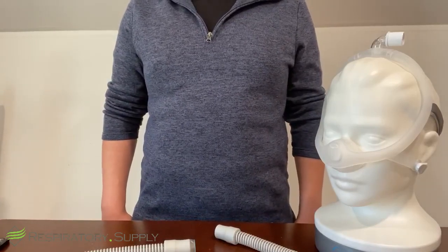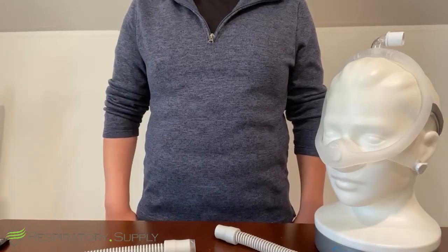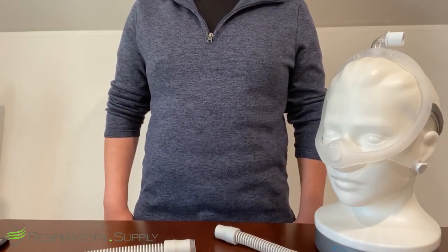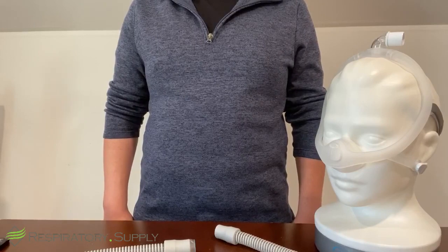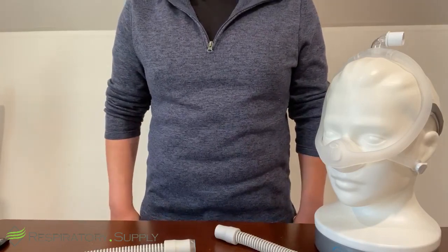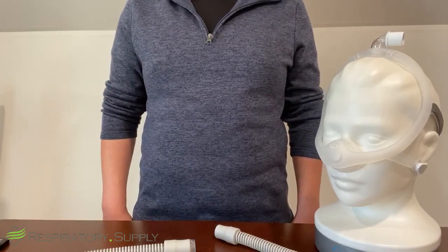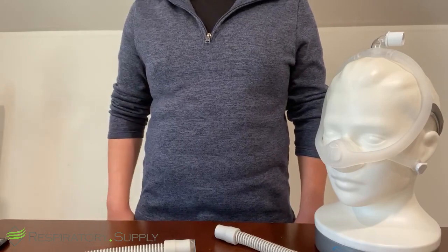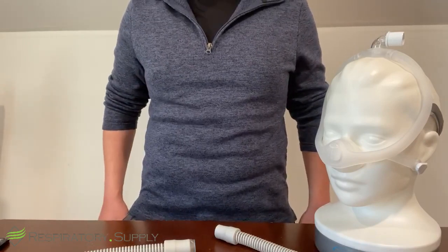My name is Nate and I'm here to show you how to connect your CPAP tube to your new CPAP mask. One of the common issues that patients have when they receive a new mask is that they're unable to get it properly connected to the tube. Either it seems like it's the same size and will not fit, like I'm about to show you an example coming up, or it just seems like it does not match at all. For instance, too big, too small, or possibly a missing connection piece.